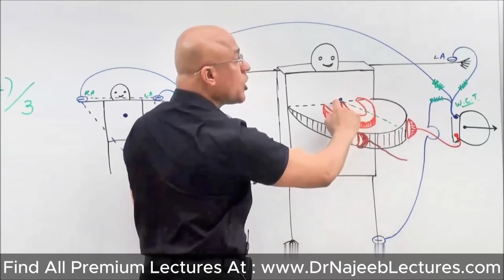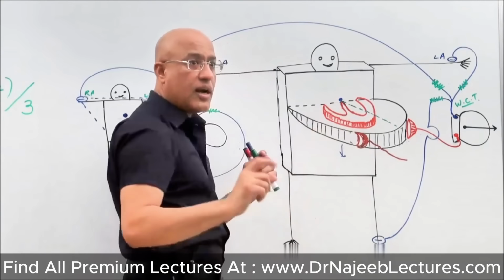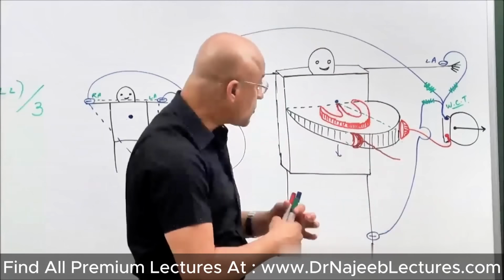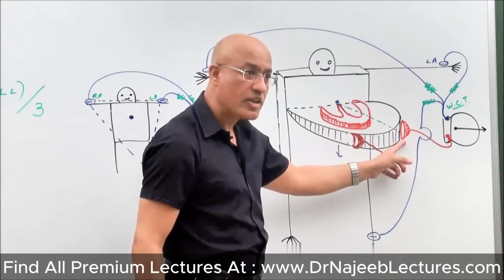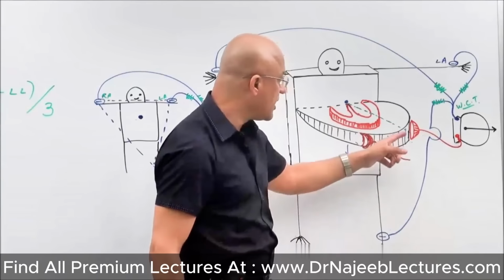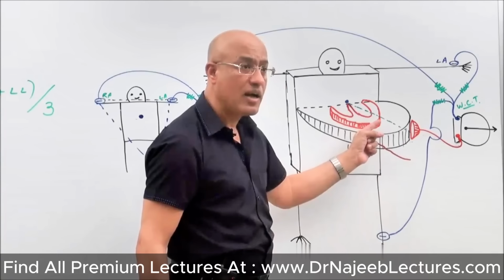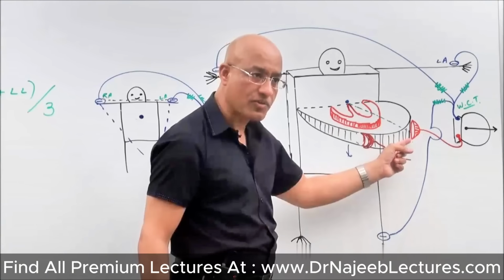So it means we do not change the indifferent electrode. When we are recording different chest leads, what we are doing is placing this exploring electrode at different positions. For example, if it is here, the axes of the leads are these, right? It means the electrical activity of the heart along the horizontal plane is compared through this axis of the lead.